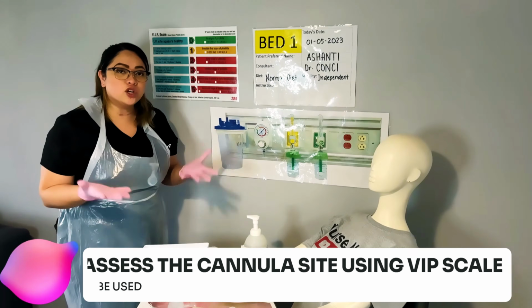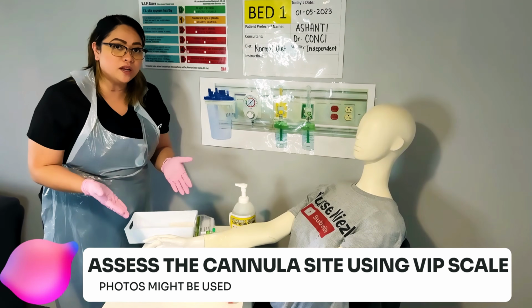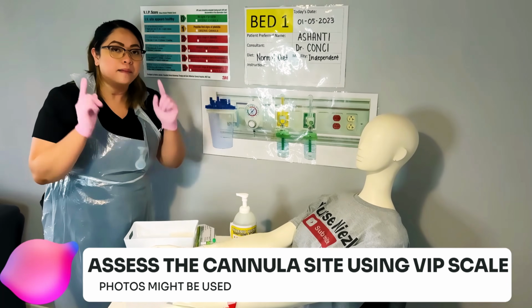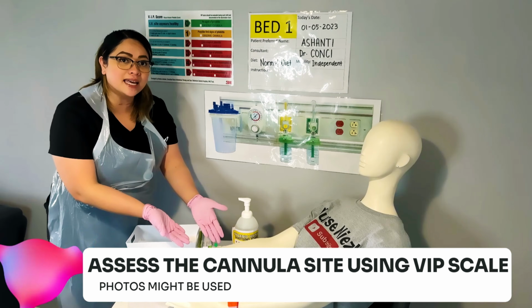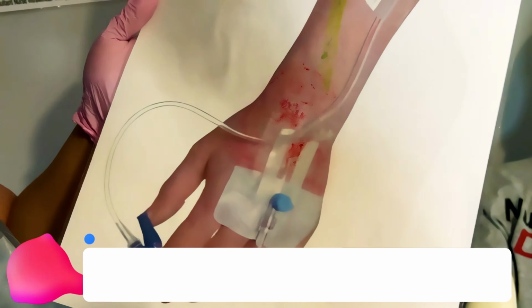At this point, nurses, remember that you will be given a picture of the visual infusion phlebitis score which you need to assess, okay? But if there's no picture given to you, then assess the IV cannula site itself, okay? Good? Alright, so I'm going to start now.